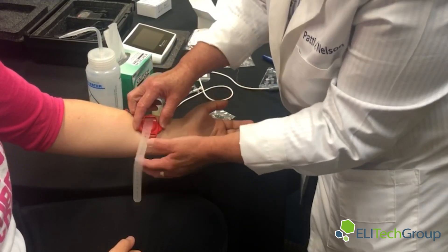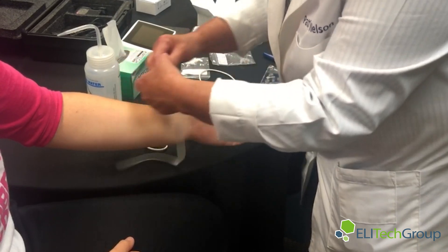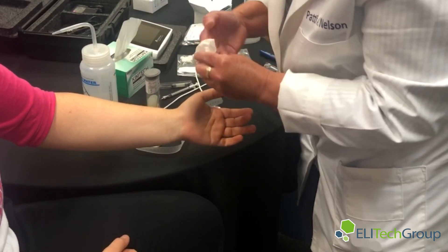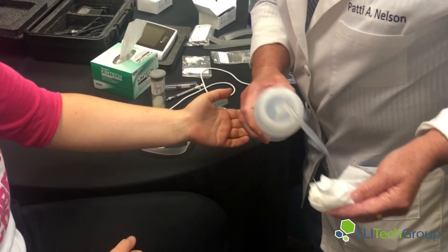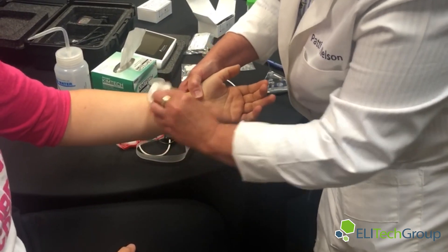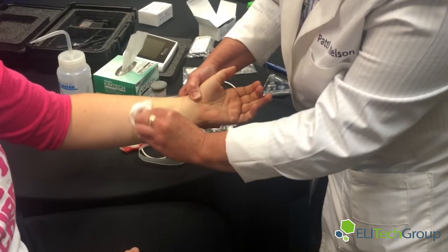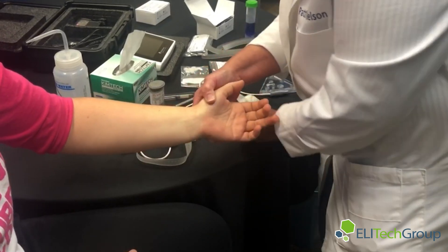We'll remove it. What you want to do is make sure you clean the area well. Take the ionized water and wipe it well, because there was a wet spot or some residual pilocarpine on the arm. We'll make sure it's clean and ready for collection.